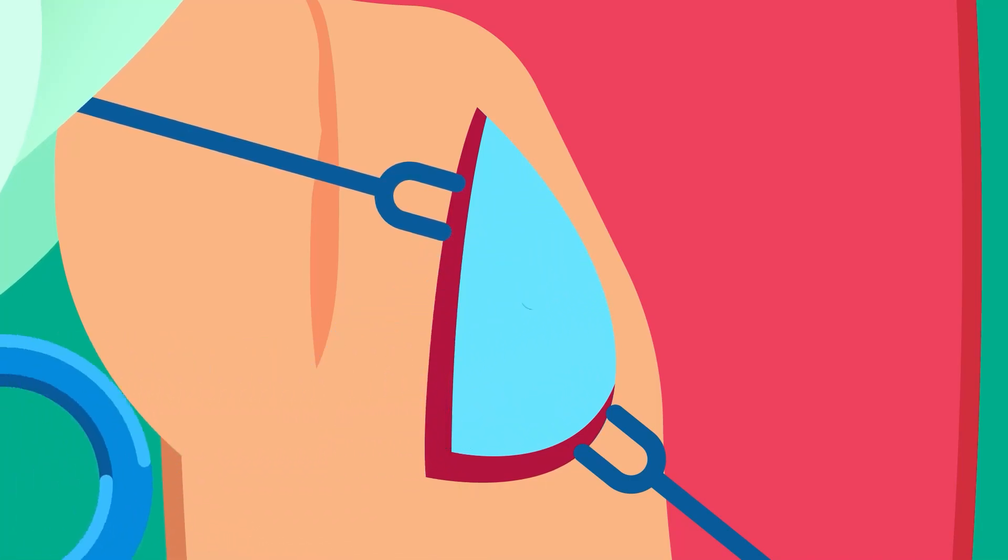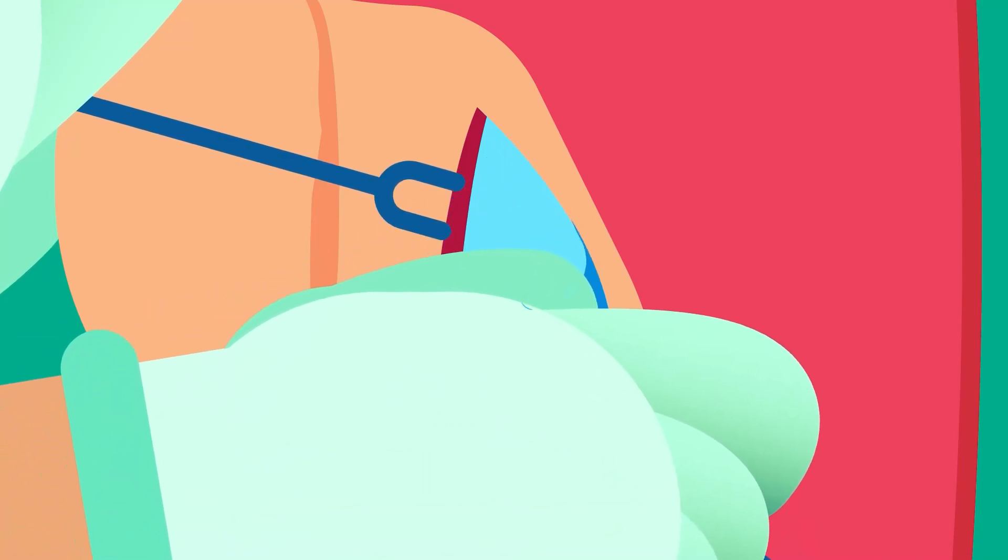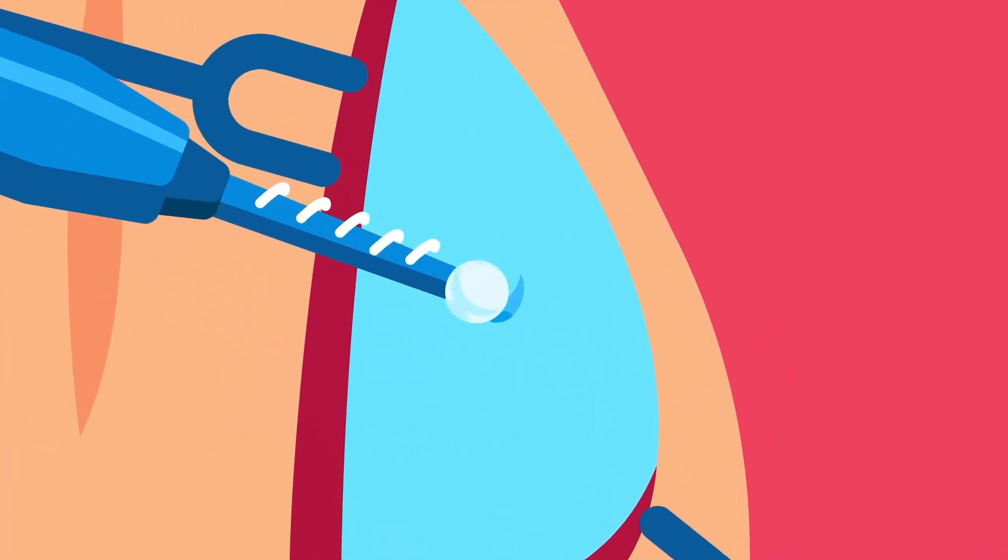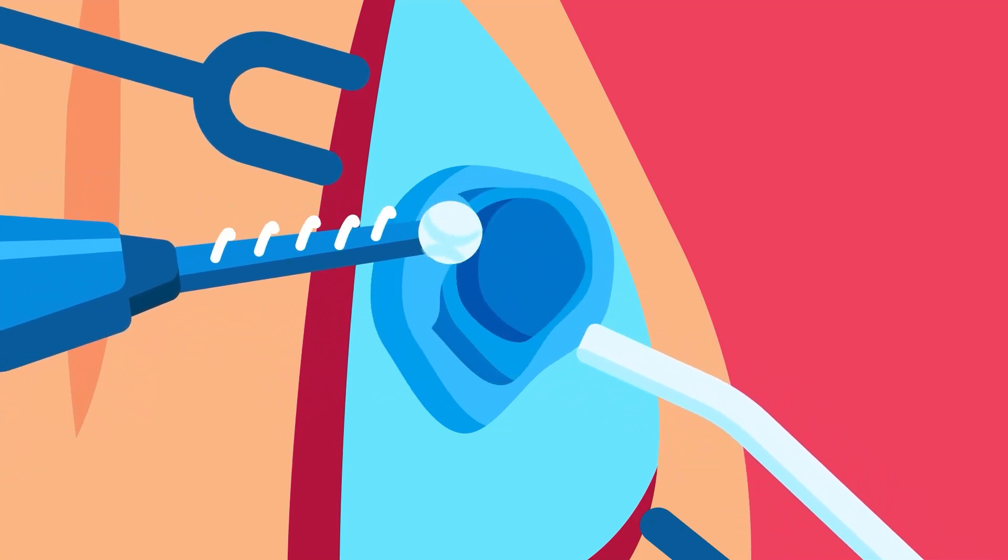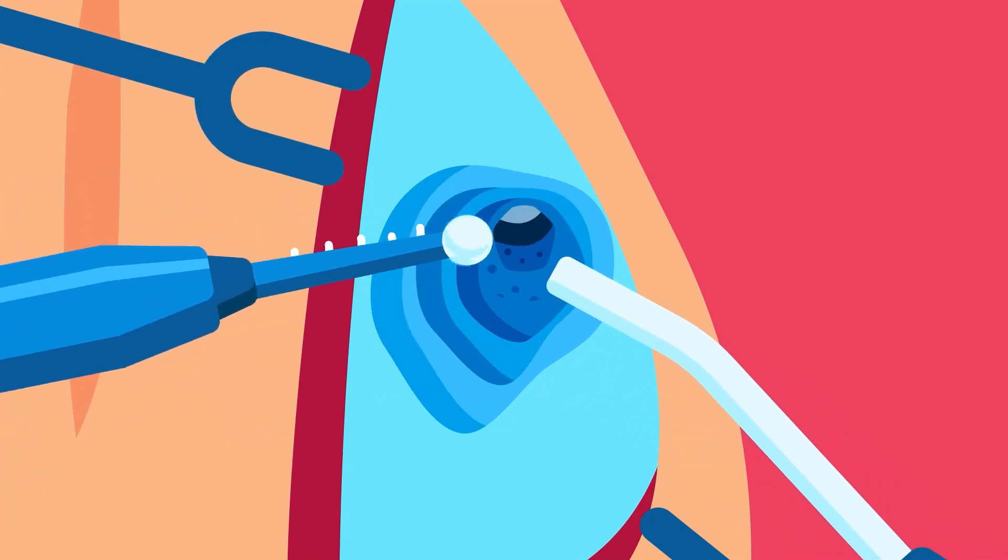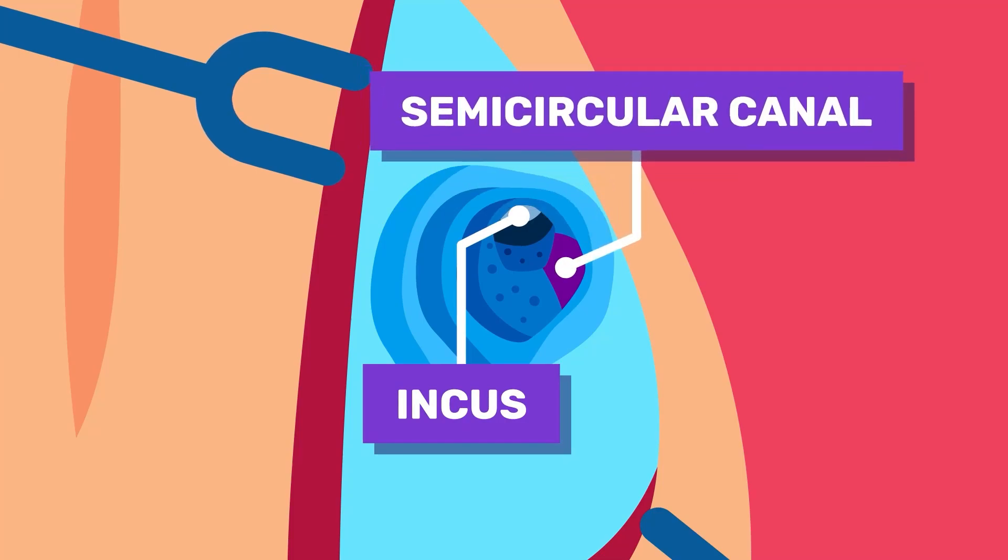Next, the mastoid bone is drilled. Suction and irrigation are deployed to prevent tissue damage. The drilling continues until the short process of the incus and semicircular canal are visible.